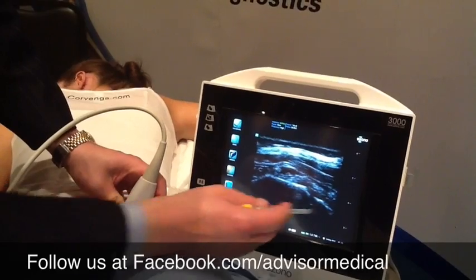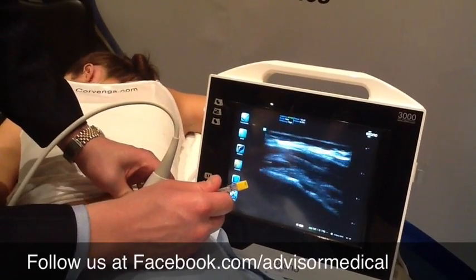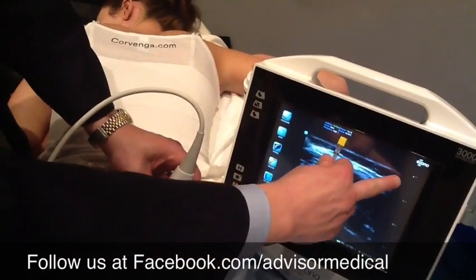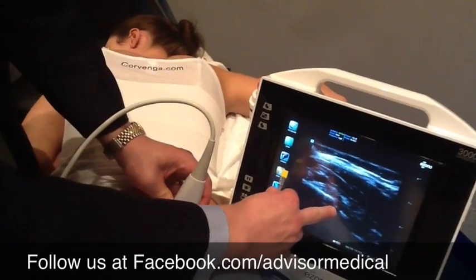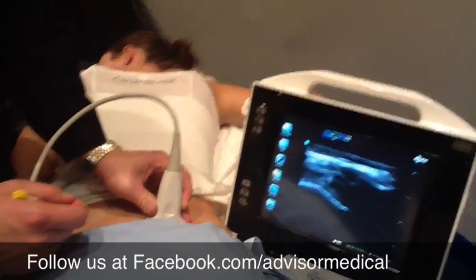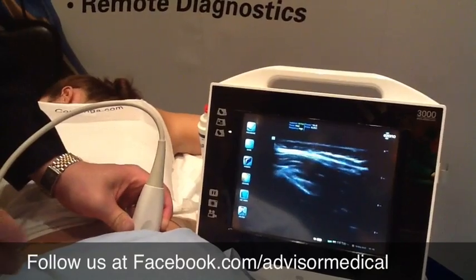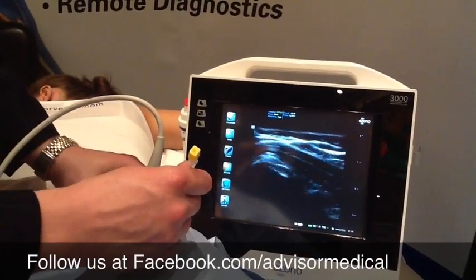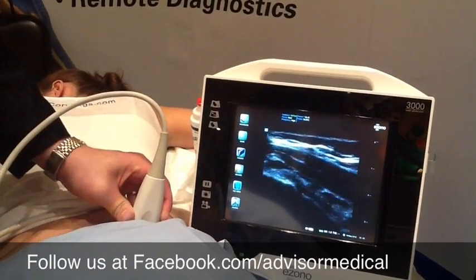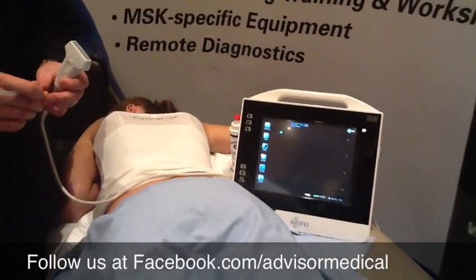With this view — sacrum, ilium — I would actually want to take the needle and go lateral, starting from this side, and go down and hit the joint from there. The joint approach varies depending on the technique, whether we want to go medial or lateral with our needle. Those are two different techniques for using ultrasound guidance for your SI joint injection.